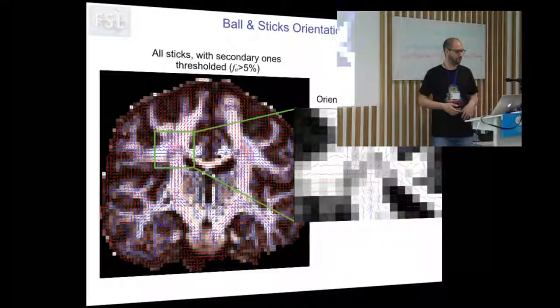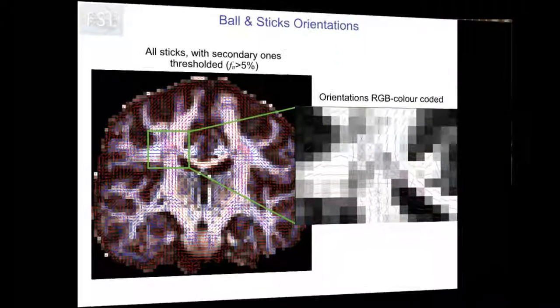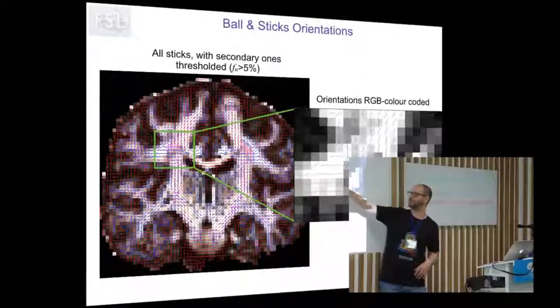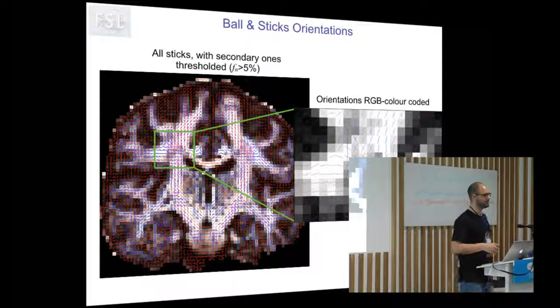And if you were to zoom on the usual suspect area, so once again the centrum semiovale, you see that in this case we have the callosal fibers coming out of the body of the corpus callosum and fanning to reach the contralateral cortex, but we also have the corticospinal fibers in blue, and well, roughly you can see the 3rd fiber component in green of a superior longitudinal fasciculus.